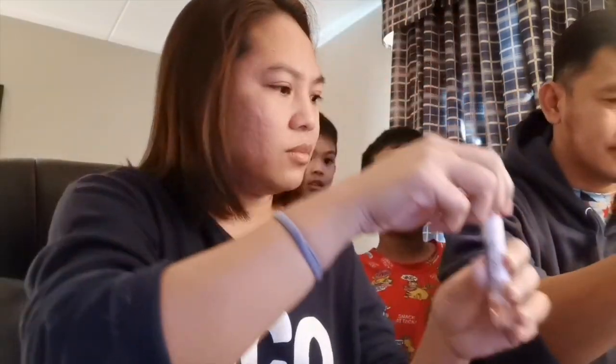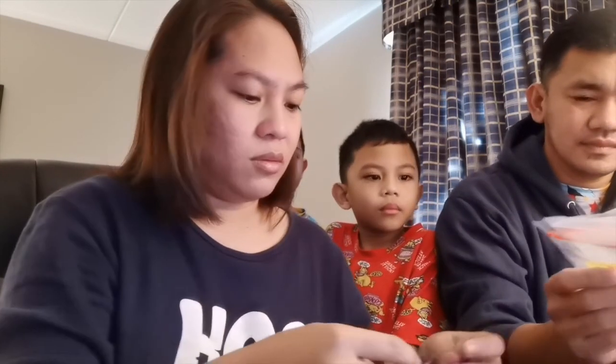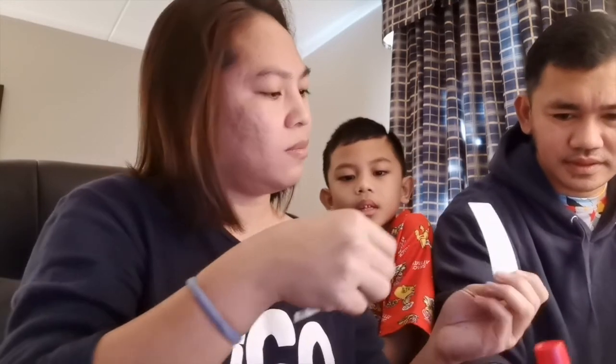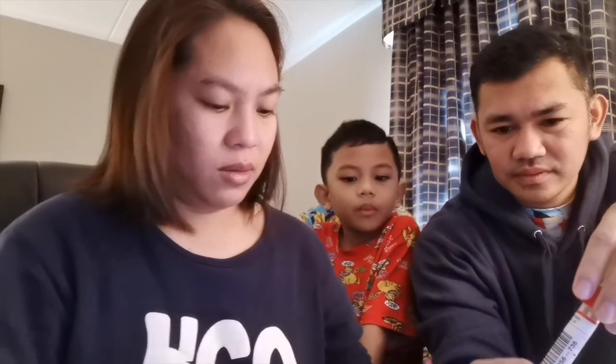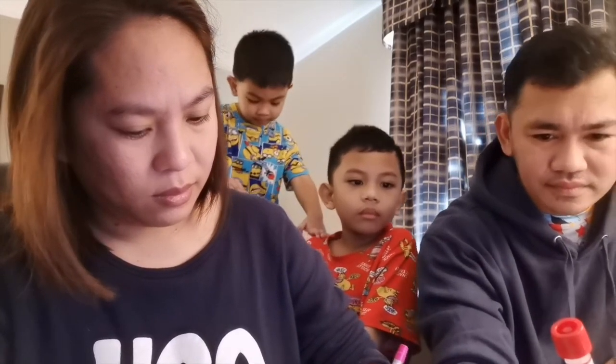Awesome. And then now you're gonna put it in the biohazard bag with the absorbent sheet that was in the package with you. With my name? Yeah, with your name and date of birth. You wrote that in already, right? Make sure the serial number is not covered. And I'm gonna read out your serial number with you. It's 056736, right? Yes. Perfect.